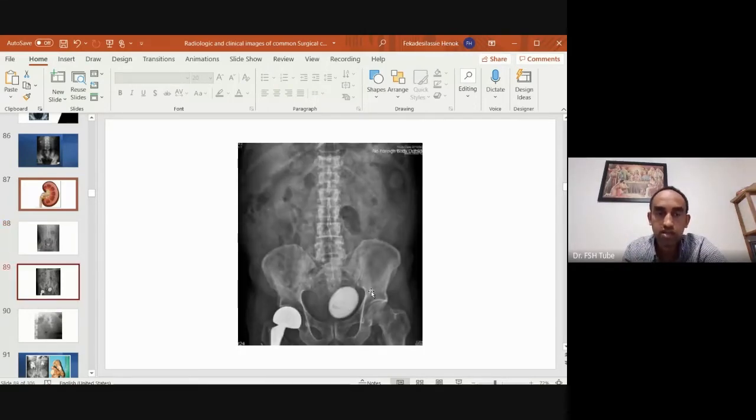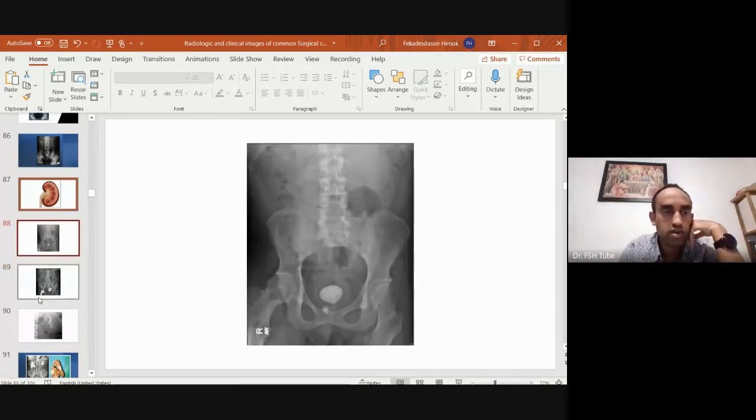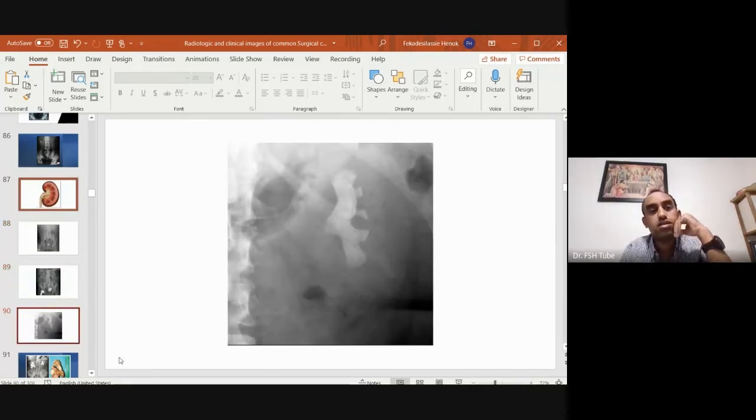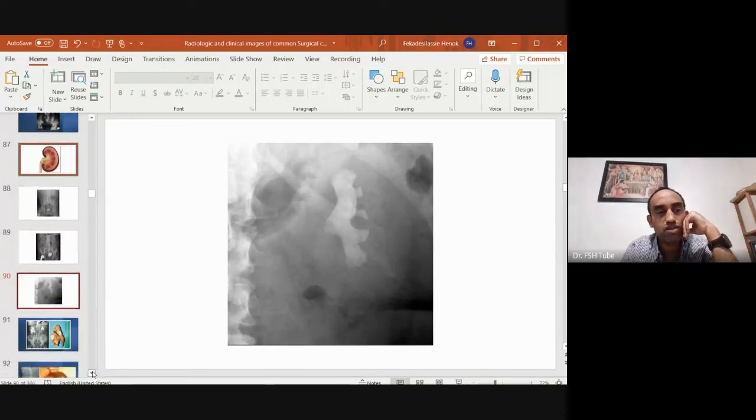So this is also another beautifully outlined eggshell bladder stone, which is big. It is growing big because the bladder is a huge cavity, so it has enough time to grow and grow and grow. Okay. So bladder stone. So what is this? Now I need a diagnosis for this one.